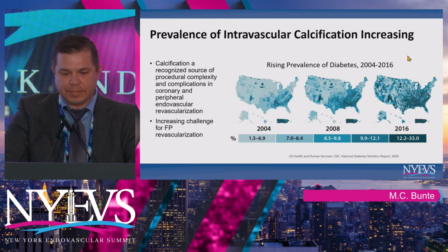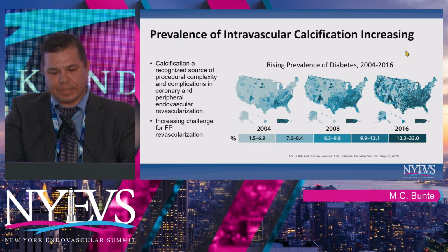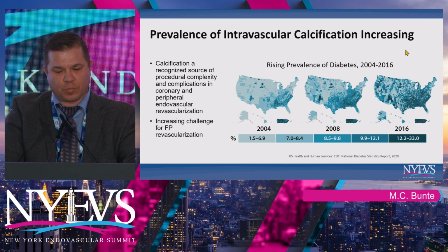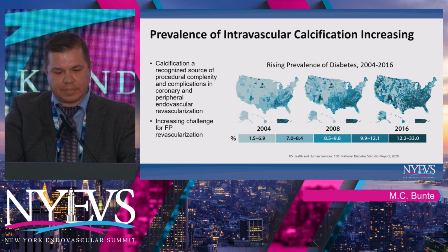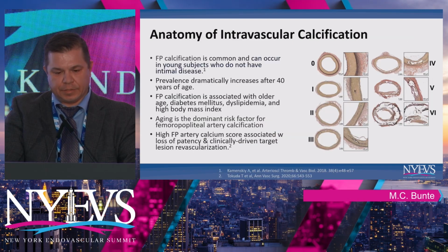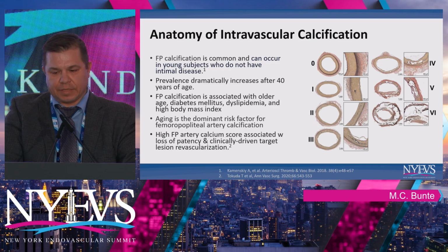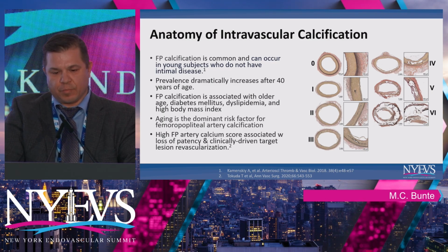Clearly, calcium is here to stay, and we're going to see this continue to challenge and vex our endovascular practice as diabetes and our population age. The anatomy of intravascular calcification, and I think as we learn more about using IVUS, is really important.